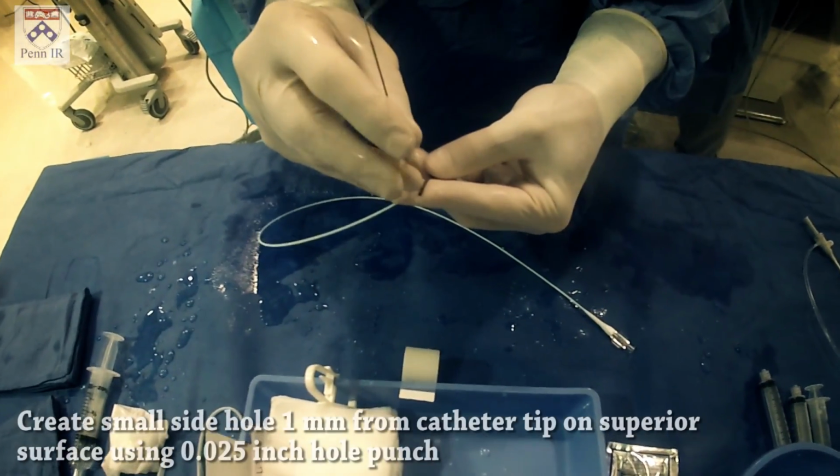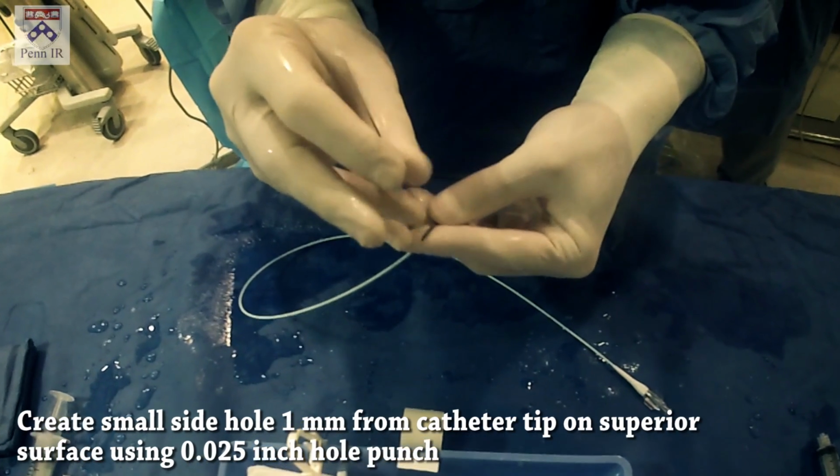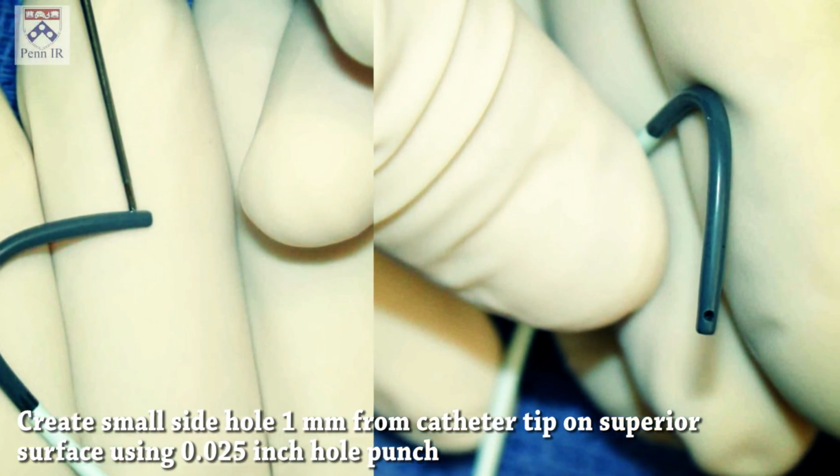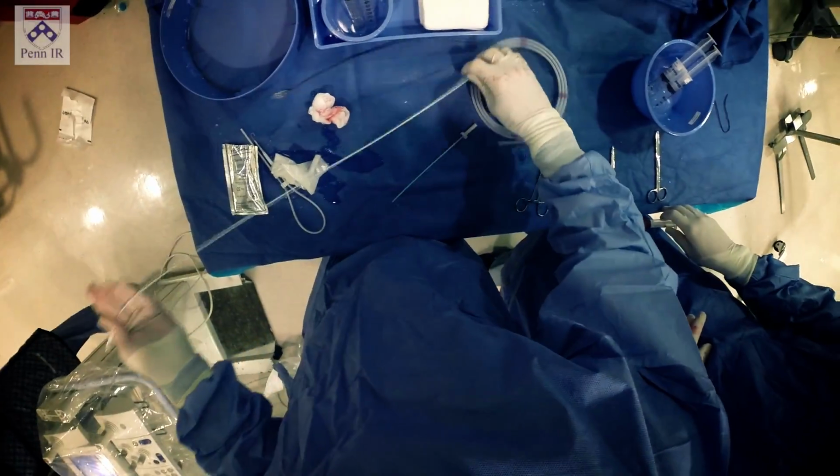We also, during our initial pause for safety, check to make sure that the correct amount of cortrosyn has infused, and that our IV is working.